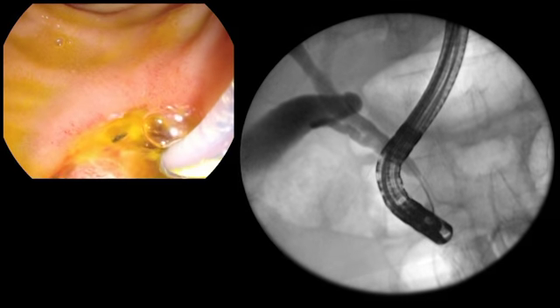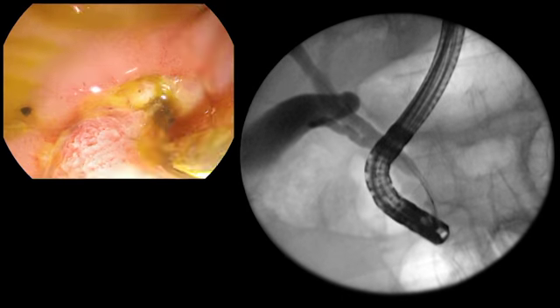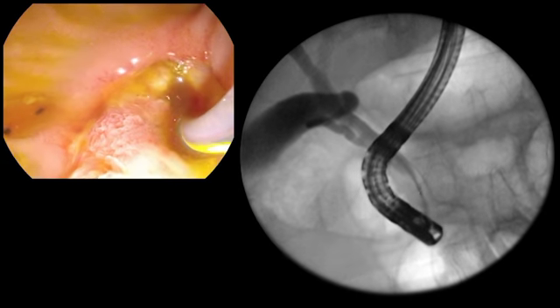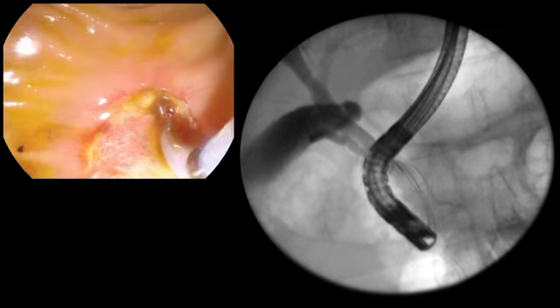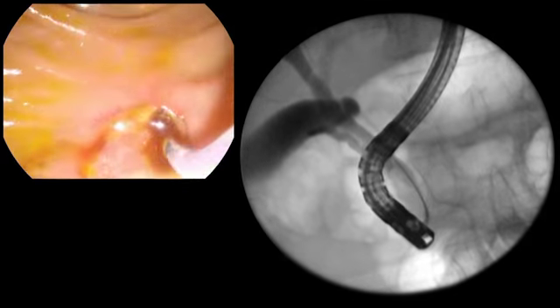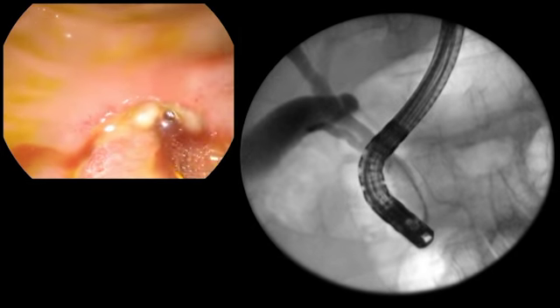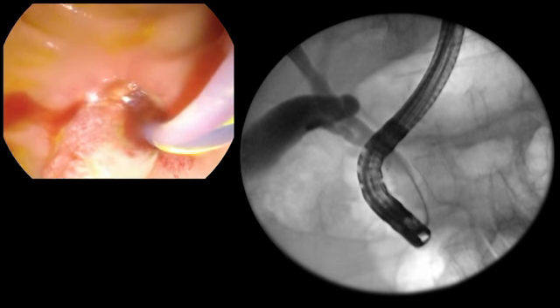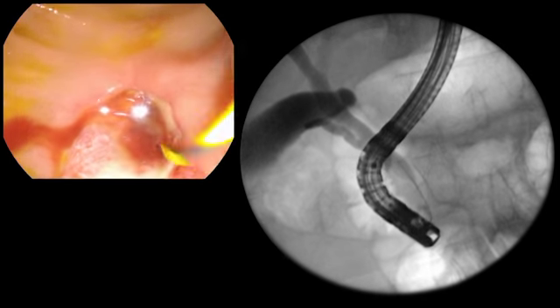Brush out. Okay, yes, you see the brush here on the endoscopy image. And now I did the brush. I brushed the stenosis. You see the stenosis is mainly here. I did 10 passages. I think now it's okay. You can withdraw the brush and you do the exchange. Okay, perfect.